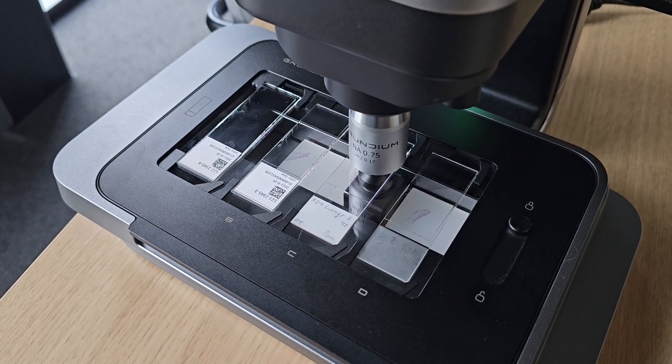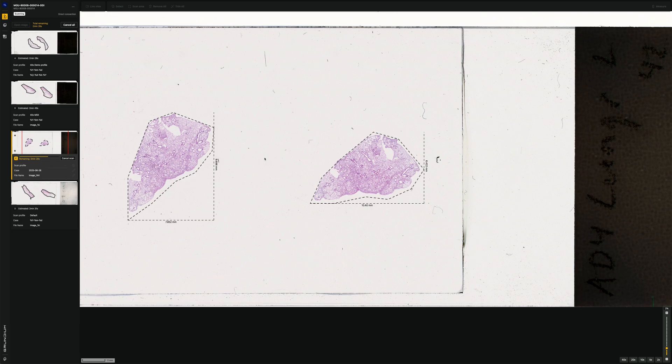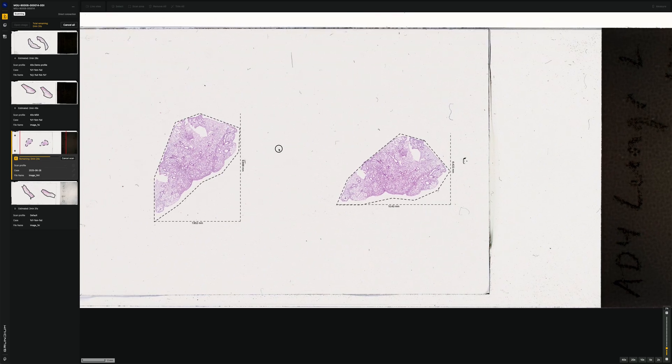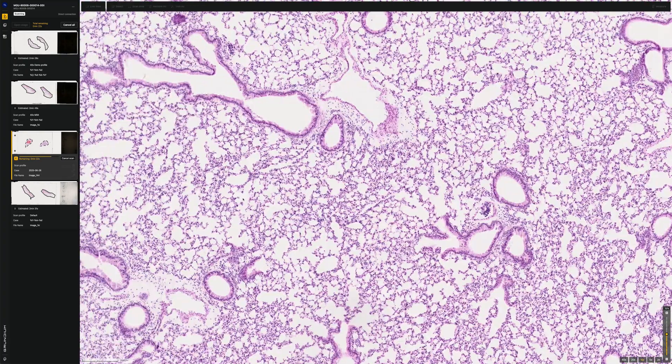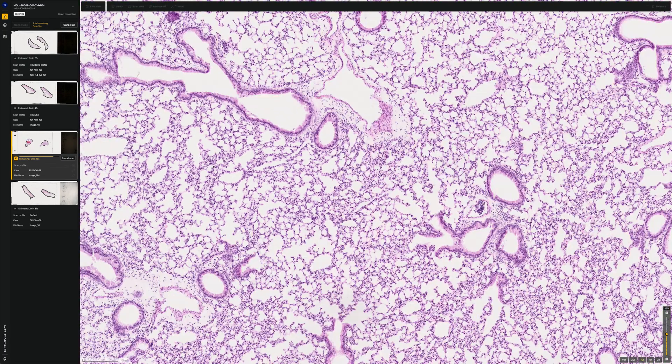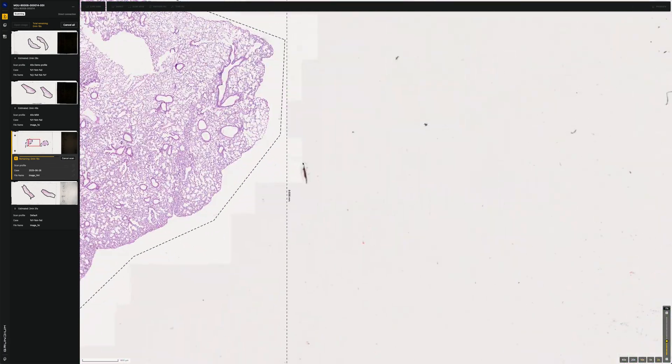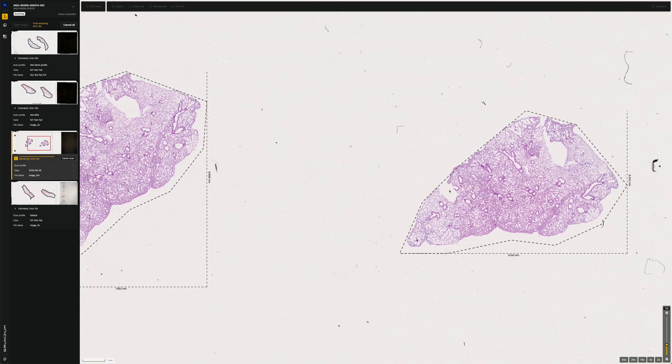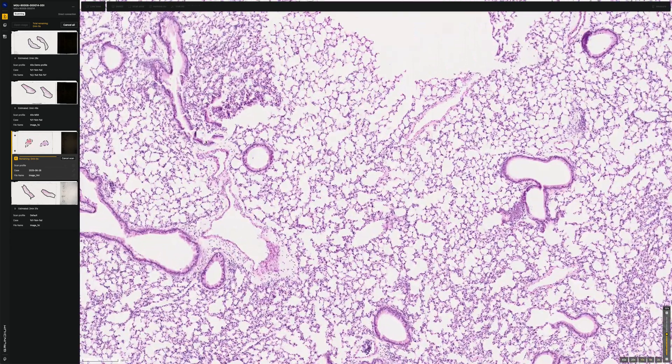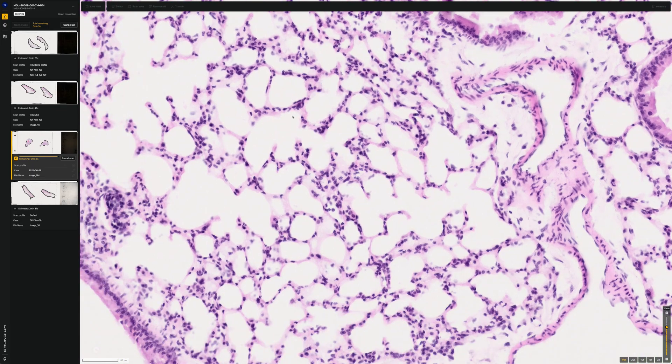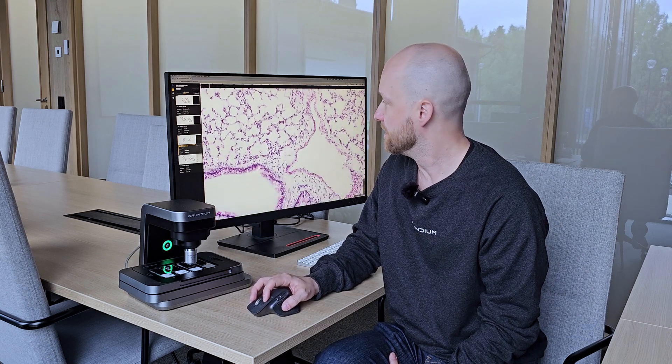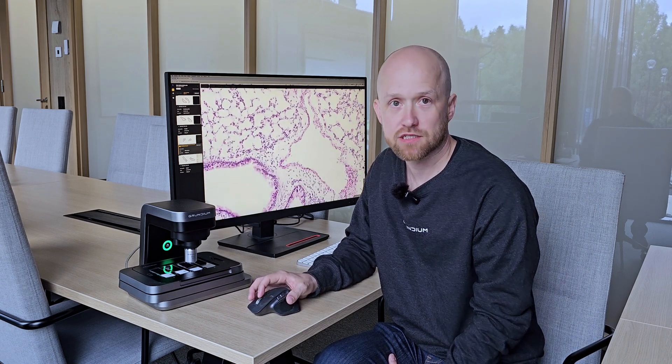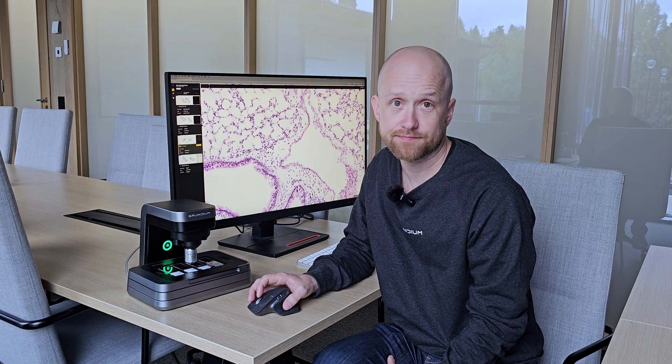One of the nice features of the M system is that you can already view already scanned areas while the device is still scanning. So for example, now we have two different tissue sections here. This one is already scanned. So while it is still scanning the other one, we can already zoom in and view this part with full magnification. That's going to make viewing the samples easier and faster.